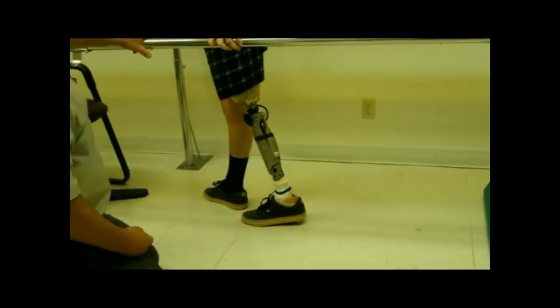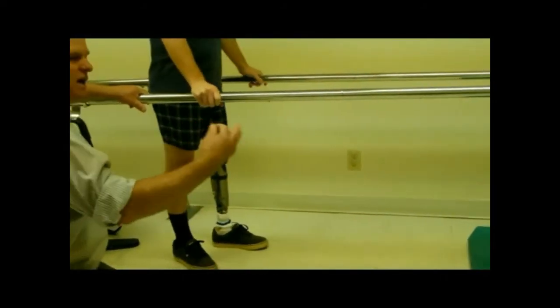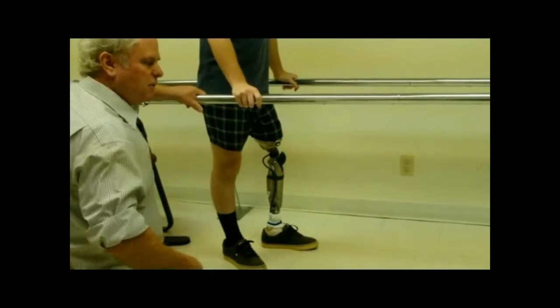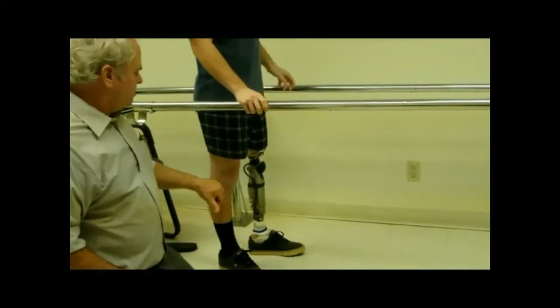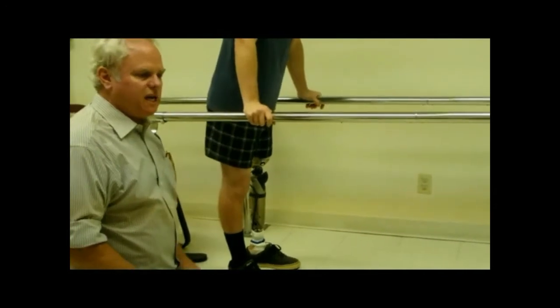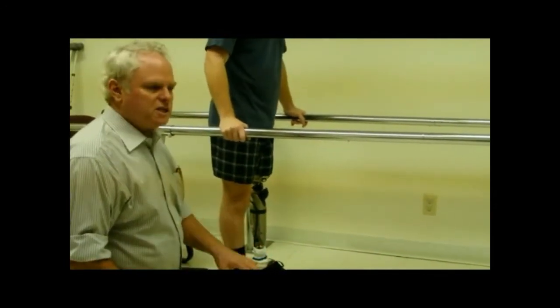There we go. So what you want is you don't want him to crash. You don't want him to land fast, but you want him to have resistance so he has time for the next step. That does a couple things. One, it gives him a natural gait going down steps. And two, it preserves his ankle and his knee from crashing on every step. So it's a real important adjustment. This I can do in the bars.